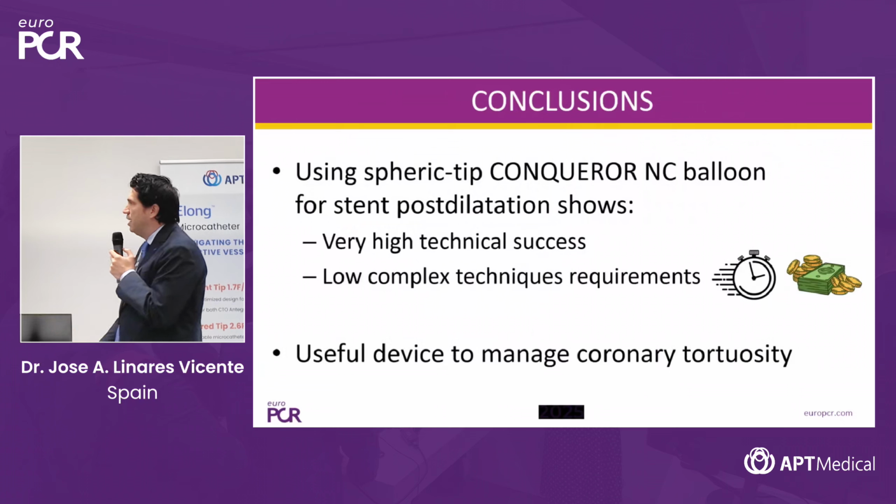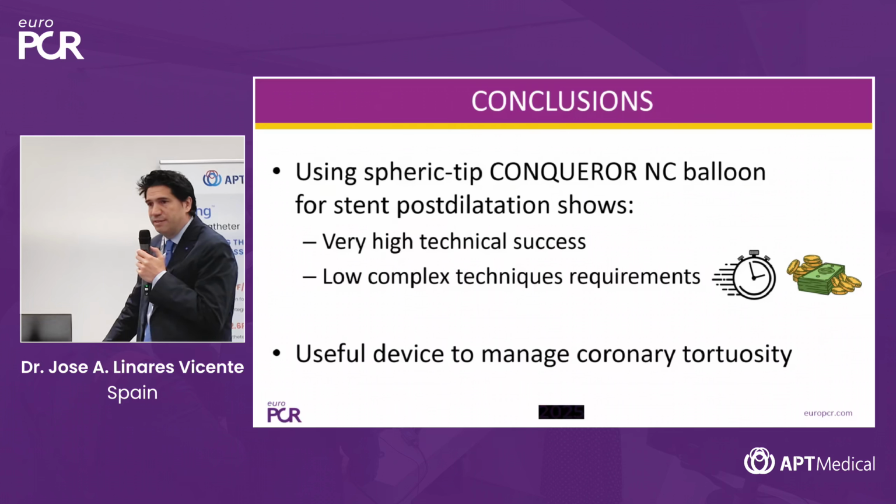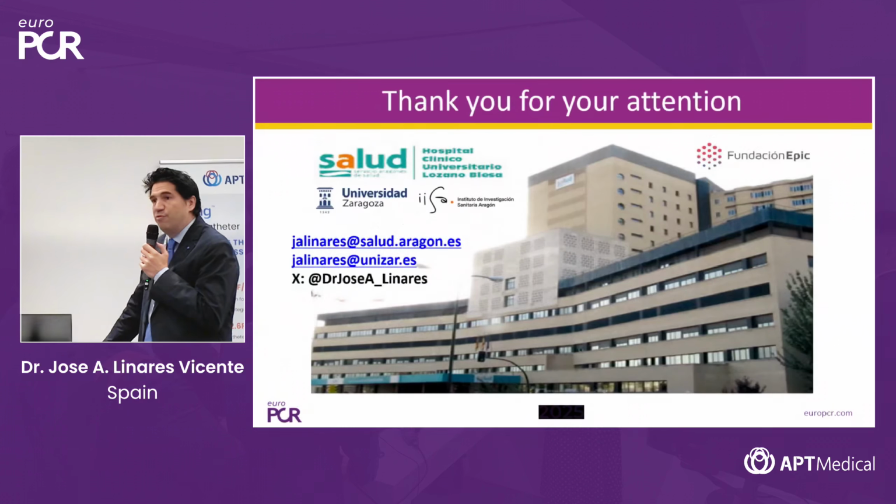So, in conclusion, using the spheric tip CONQUEROR non-compliant balloon for stent post-dilatation shows a very high technical success and low complex techniques requirements, saving time and money, so important in our daily practice routine, and it's a useful device to manage coronary tortuosity. Thank you for your attention.